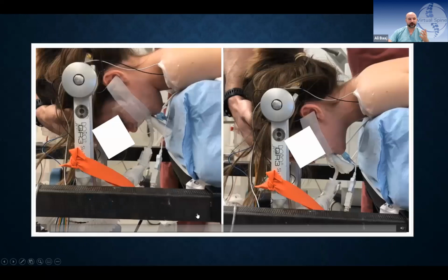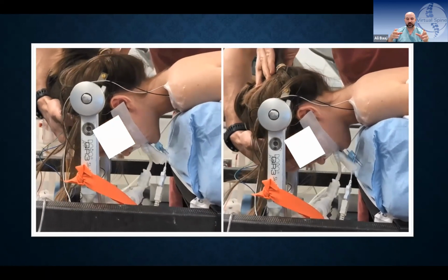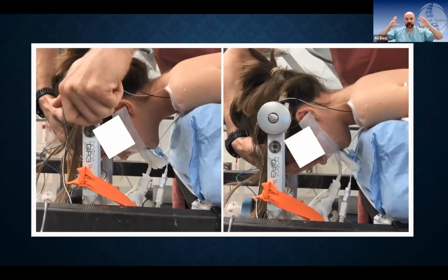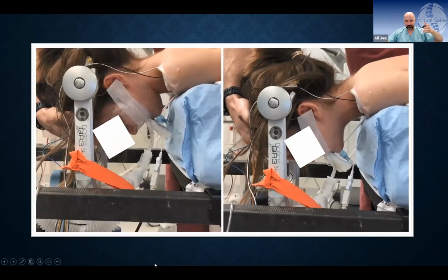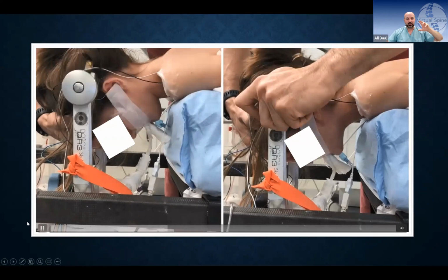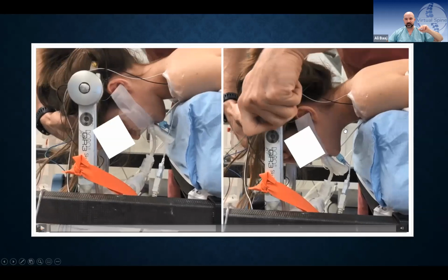I want to show this video, and I've shared this with a few colleagues in the past. This is how I now do these. I use the Mayfield pins. If we need to do a decompression, I'm happy to flex them. But just by simply turning the knob of the Mayfield, I extend them back into the position I want. So I don't readjust everything. I literally fix them in place, and then with the Mayfield knob, I'm able to flex them to the desired position and extend them. And you see the difference here. This is flexed. You see the fold here. This is nicely extended, and this is the position I like to fuse patients in, on the right side, not on the left.